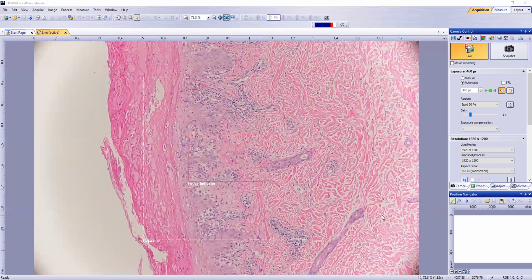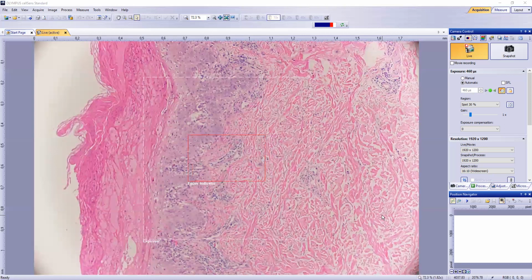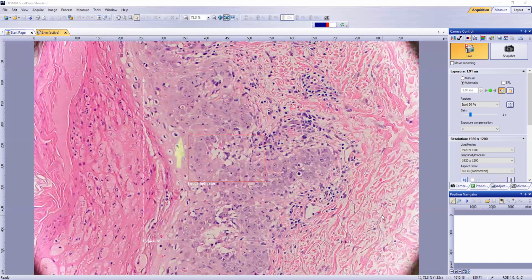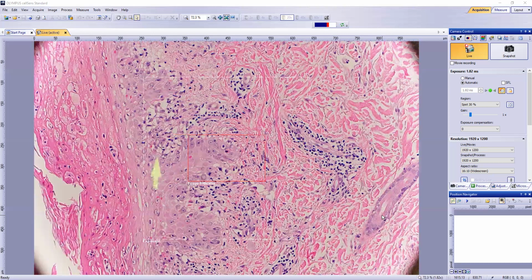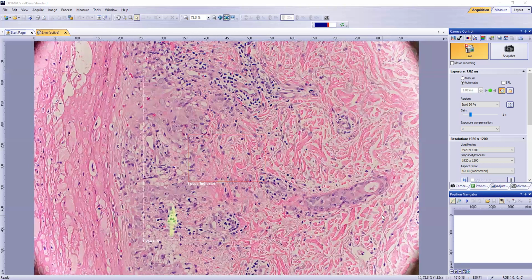In Erythema multiforme, we saw lots of necrotic keratinocytes, but in PLEVA, you'll typically see just a few necrotic keratinocytes. So you won't see as many, and I'll point those out here. There's a necrotic keratinocyte there. There's another one there. But you can see that they're not as plentiful as we saw in Erythema multiforme. You have basal layer vacuolization, as you can see here. Oh, there's another apoptotic keratinocyte there. So you have vacuolization of the basal epidermis.